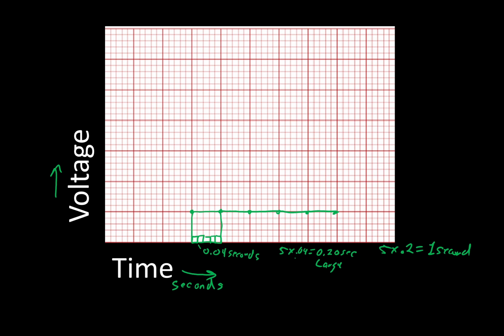And so when we do any measurements on any types of rhythms, we talk about how many seconds long it is and things like that. Well, you can also just communicate and say small boxes, assuming that everyone knows you multiply times 0.04 to make sense out of that. I will apologize in advance. I tend to drop off the point, so instead of saying 0.12, sometimes I'll just say 12. And hopefully you'll get used to that as this goes on.